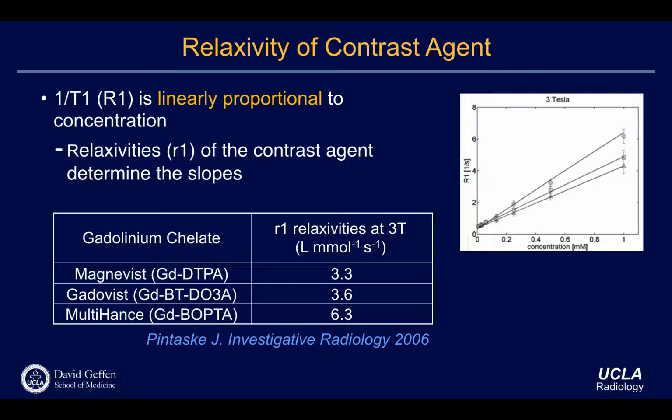So for example, some of the iron oxide-based nanoparticles go into the intracellular space later, like 48 hours or later. Then the relaxivity changes are different. So you have to have two different relaxivities: one for the free space versus the intracellular space. I mean, some people do that, I think in in vitro studies or something. But I don't think it's well studied because those contrast agents are not practically or clinically used. So it is still in research. Yeah, but I think that's a great question.